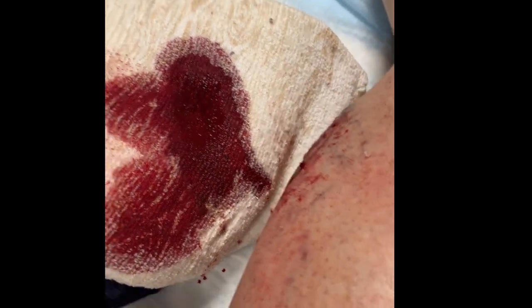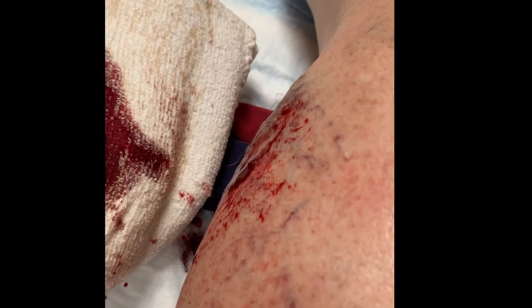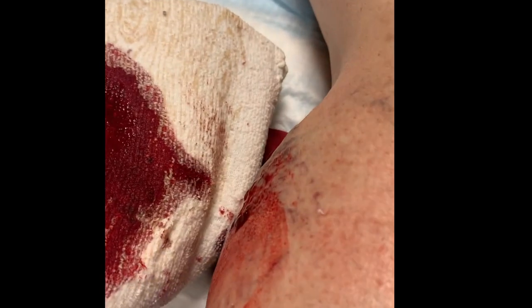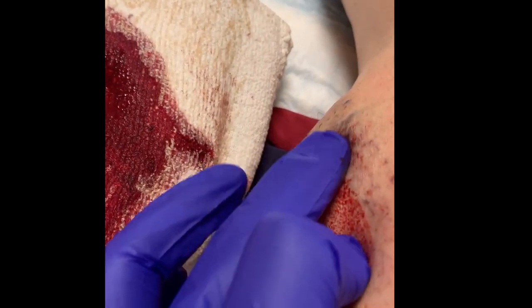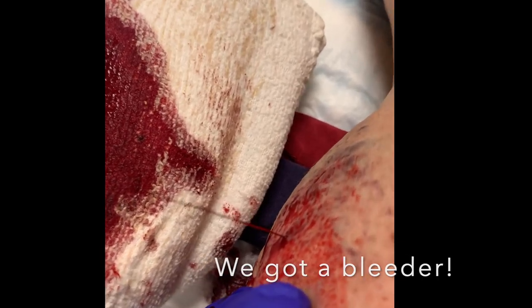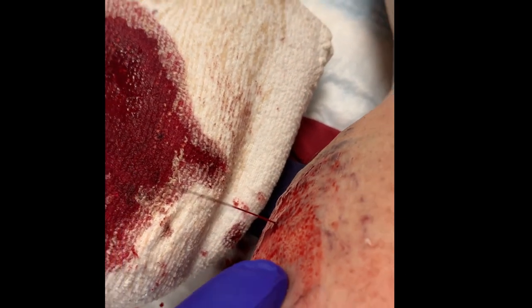It's not doing its thing right now. Now it's not squirting. How rude. It's bleeding still. Alright, so I can see where it's coming from.